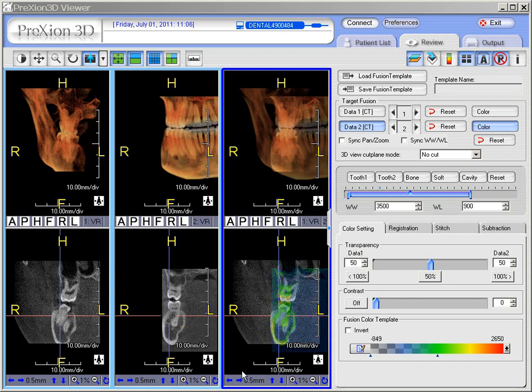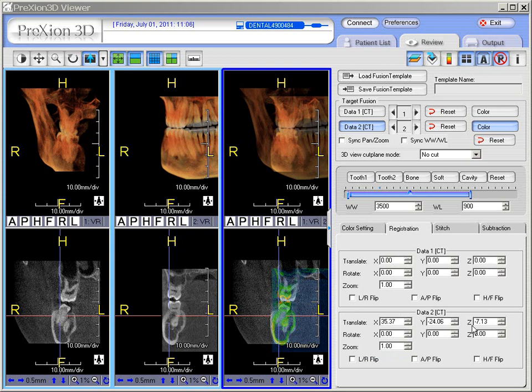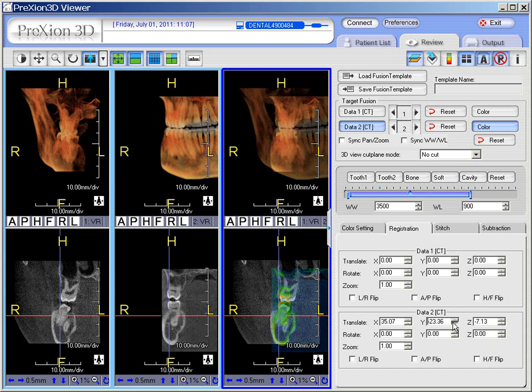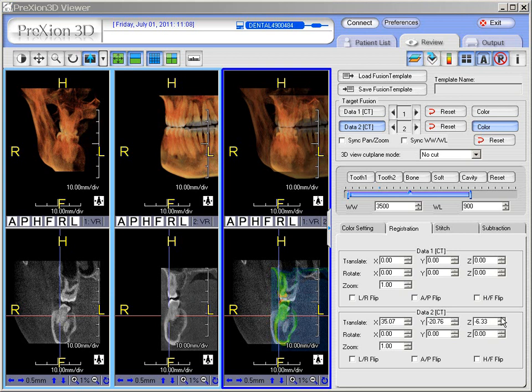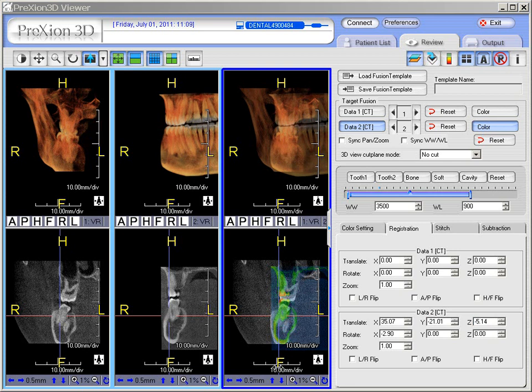To fine-tune the alignments and adjustments, there are a number of things we can do. First, we can click on the registration tab. When we click on the registration tab, we have items X, Y, and Z for data set 1 or data set 2 — we can select whichever one we wish to work with, but in this case data set 2 is our preference. Notice by clicking translate in the X-plane, we're moving left to right. In the Y-plane, it's a mesial-distal type projection that we're adjusting, going back and forth mesially and distally. The Z-plane allows us to move up toward the head or superior, or going down to inferior — toward the foot. That's what the H and F symbols are indicating: head and foot, or superior and inferior.